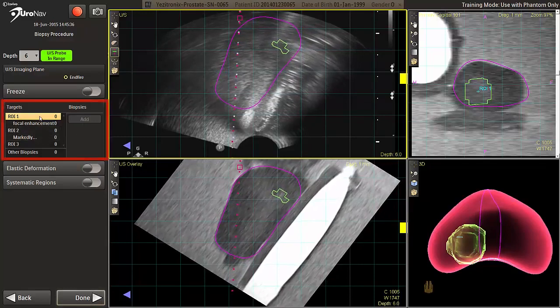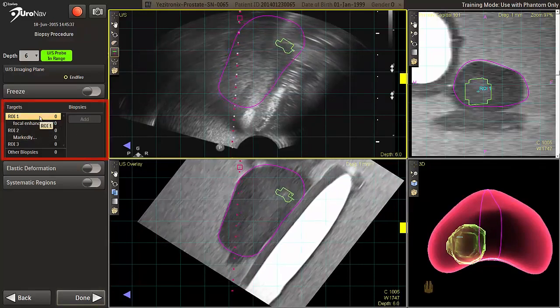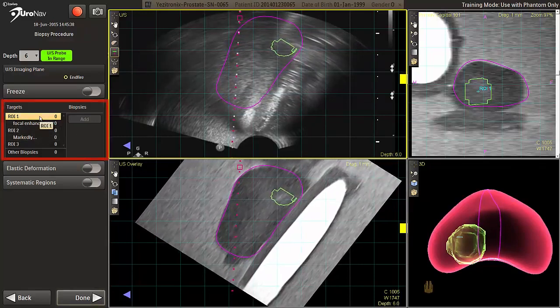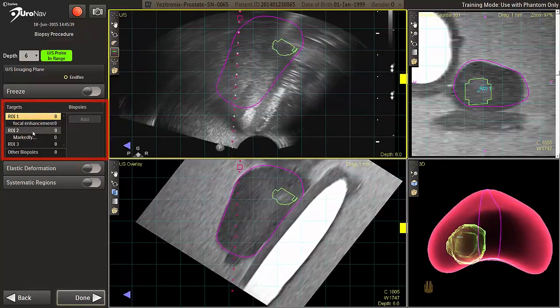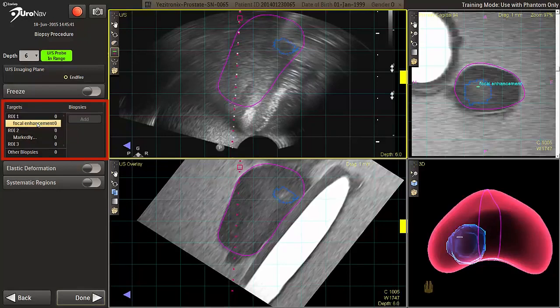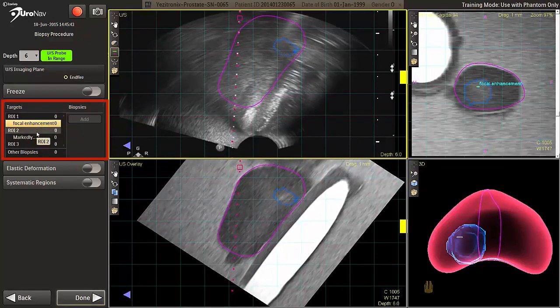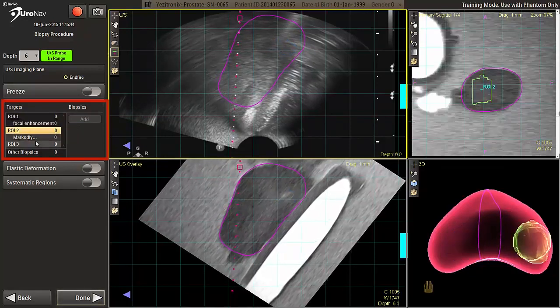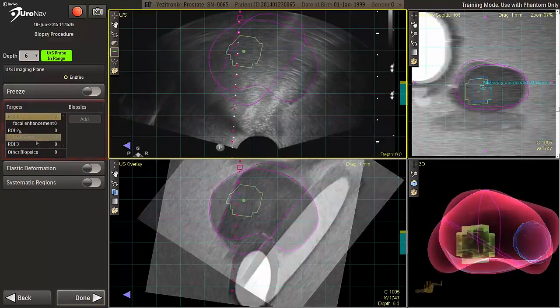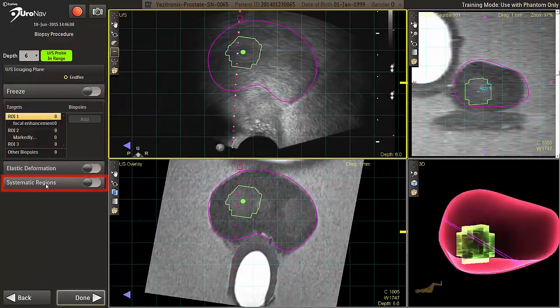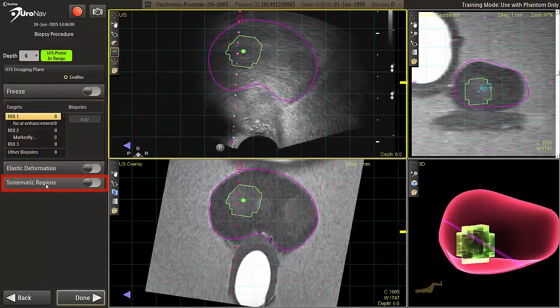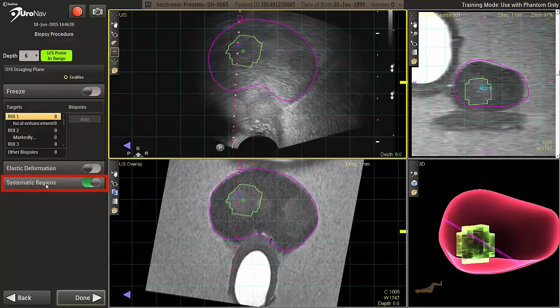The intuitive target and biopsy lists on screen left activate the target of interest and track the number of cores taken at each location when the add button is pressed. If users want to map systematic regions, they can be added to the end of the target list by pressing the toggle button.